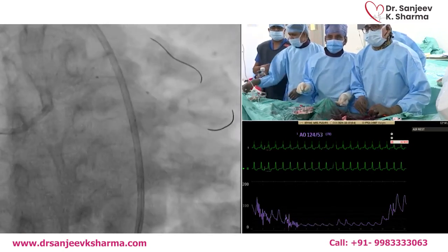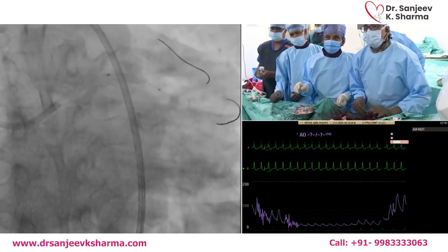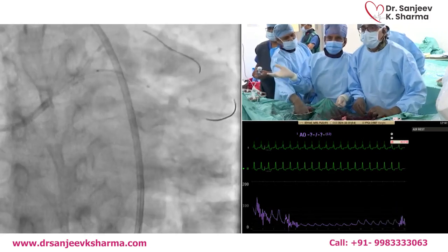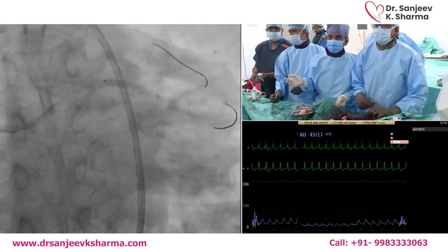And we have the balloon ready? Yeah, 15 is good. This is okay. You can go here. We are within there. Go here, 20. You can go further in.